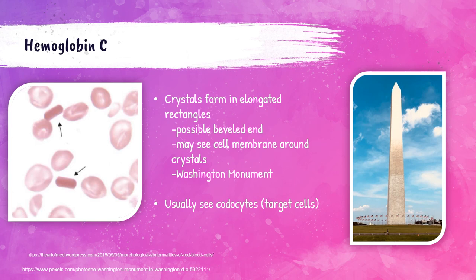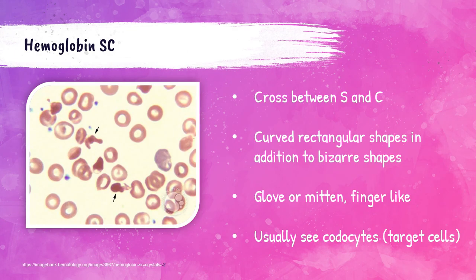The arrows in the photo point to hemoglobin C crystals. Hemoglobin C is an abnormal type of hemoglobin. These are very condensed elongated rectangular shapes that resemble the Washington Monument. You will often see target cells (codocytes) in patients that have these crystals. Hemoglobin SC crystals come from a cross between hemoglobin S and hemoglobin C — they can be curved rectangles or bizarre shapes that look like a mitten or finger-like projections. As with hemoglobin C crystals, you will frequently see target cells in the peripheral blood smear of patients that have hemoglobin SC crystals.